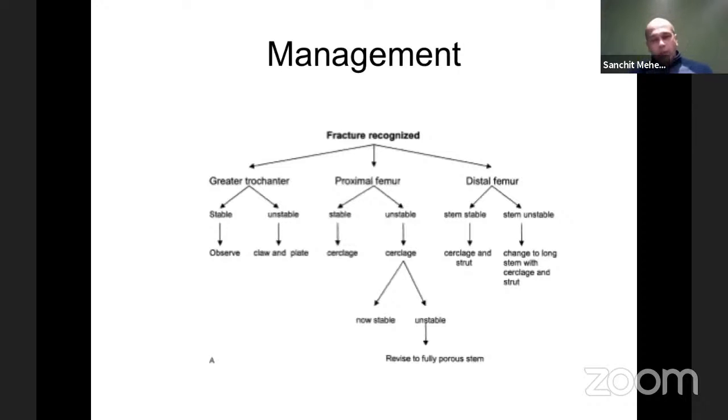So when we talk about intraoperative fractures, this is the rough algorithm that you could go by. This depends on if the fracture is recognized intraoperatively. Okay. And like we saw A, B, and C, so the proximal metaphyseal side of things, so greater trochanteric fractures, if they're stable, then you just observe them. If they're unstable, there are quite a few claw fixation devices. Now, whether it's the Synthes one, the Smith & Nephew one, or the Zimmer claw plate, they're pretty good.